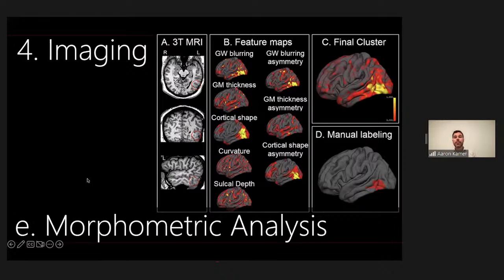And one of the other things that can be done is some complex morphometric analysis. This is coming more and more in vogue, where computer processing is used in order to assess where different characteristics are happening. For most imaging centers, this is still just in the research realm. It's not super widely used at this point, but there are a lot of interesting tools that can be used to basically either look at the brain in a very unfolded way that can draw our eyes to areas of abnormality, or to do a three-dimensional model where certain characteristics are accentuated.